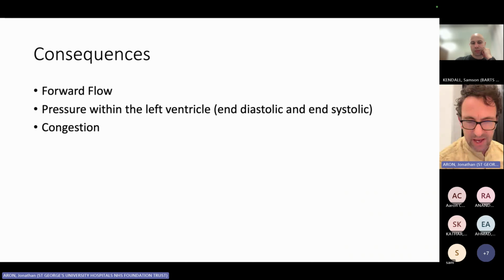So you wouldn't see any of that. If you think back to the video, which was going fast, you didn't pick apart any of those things. So you have to keep in your head, you have to get a good picture of your left ventricular outflow tract, get a few cardiac cycles, and importantly, get a respiratory cycle.